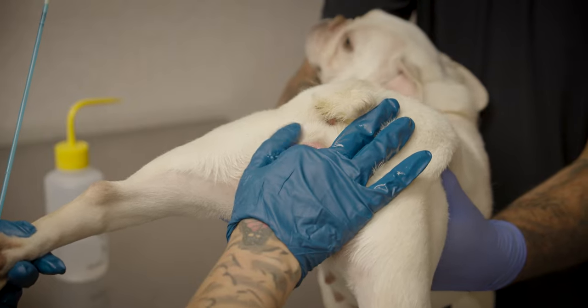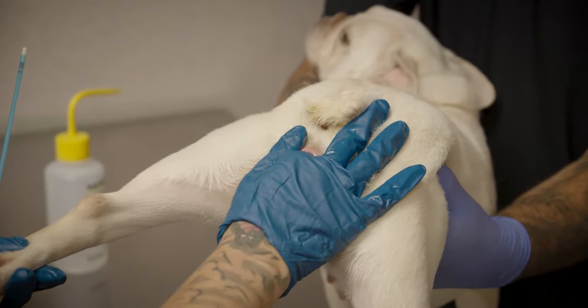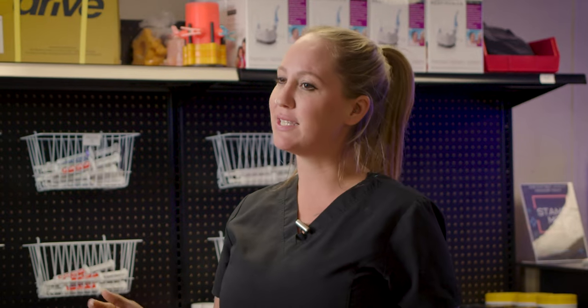We recommend that you at least keep your finger in for about 10 minutes. You can also hold up the female during this time. And this now completes the artificial breeding process.